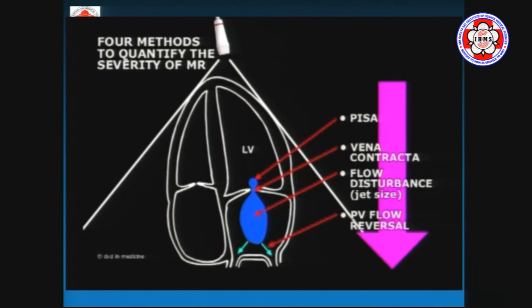Let's look at grading of mitral regurgitation severity. If you look at an MR jet by echo, there are several different components. First, in this apical four-chamber view with LV and LA, you have this area of proximal flow convergence — that's where the blood is getting ready to come in through the regurgitant orifice. Then you have that narrowed orifice, which is like the vena contracta. And finally, you have the regurgitant volume and the downstream effects. In Bangalore terms, this would be like Bangalore roads — all the traffic trying to get into this narrow orifice, and then finally getting out.